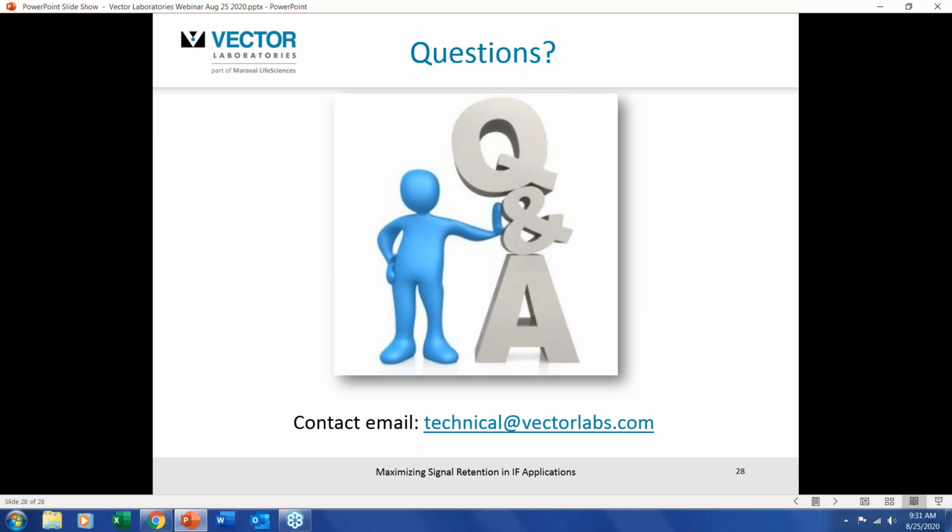So maybe this was an archive specimen, and for whatever reason we're finally getting around to undertaking that. Have a look at the literature out there. I did pop up one reference about en bloc antigen retrieval in frozen tissue. I would certainly highly recommend looking at antigen retrieval methodologies for overfixed material, particularly if it is an aldehyde-based fixative, which it is. So certainly that would be recommended.